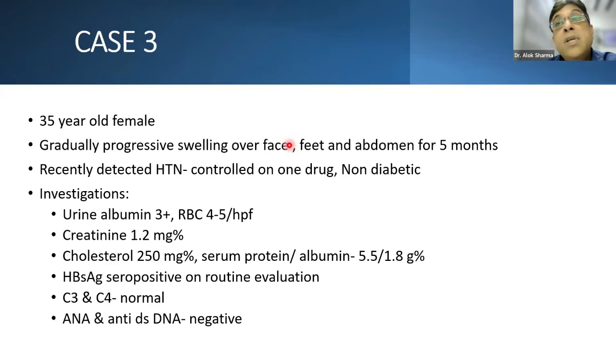Okay. And suppose there is a condition where you have only one glomerulus in the biopsy, and that glomerulus is showing segmental sclerosis. So you don't have a focal criterion on which you can create your denominator, right? 50%. You have only just one. But even in that case, you have to tell that there is a segmental sclerosis in that glomerulus.